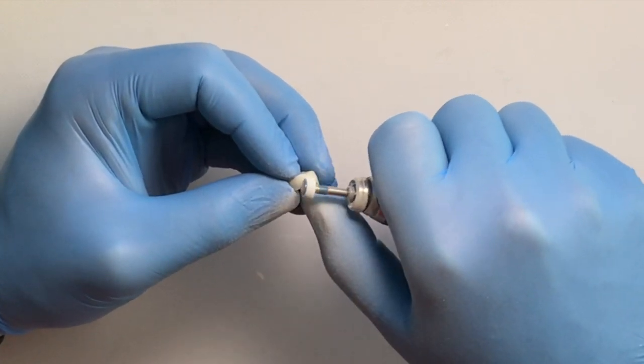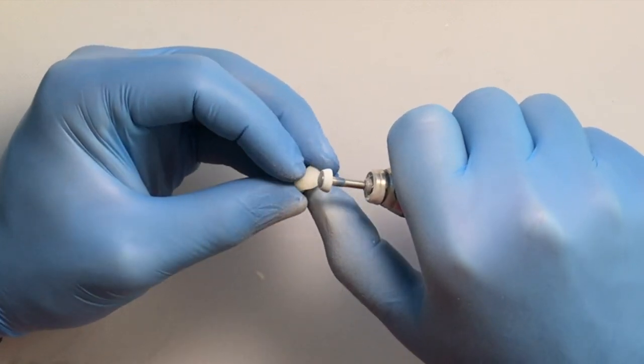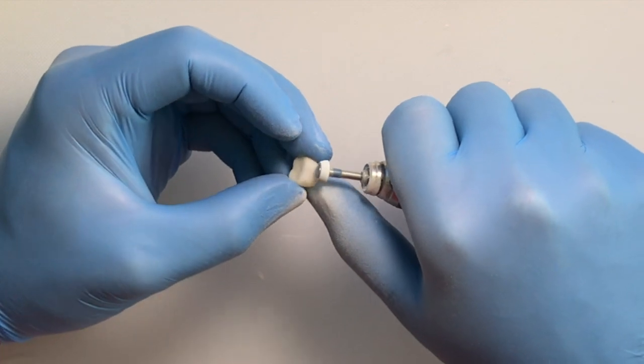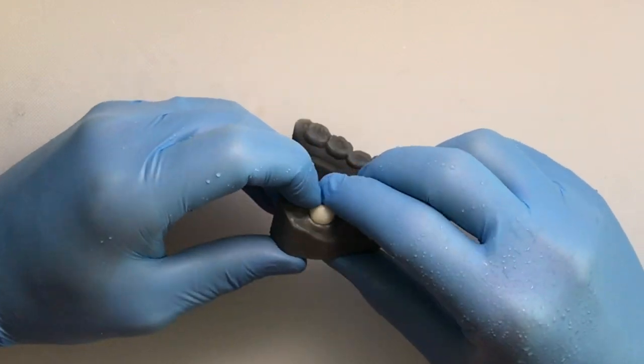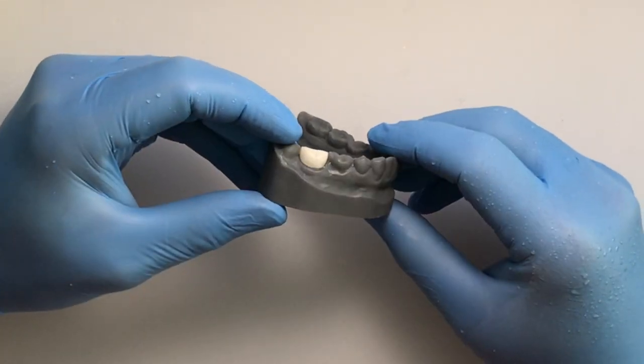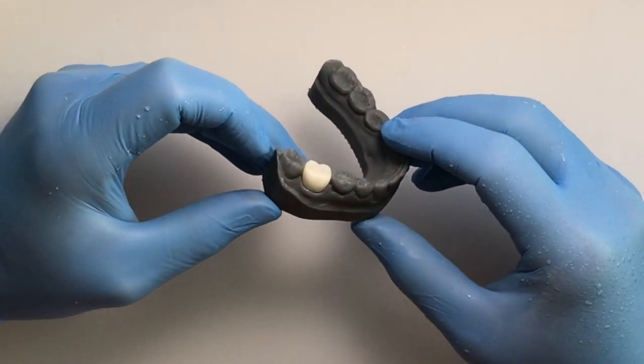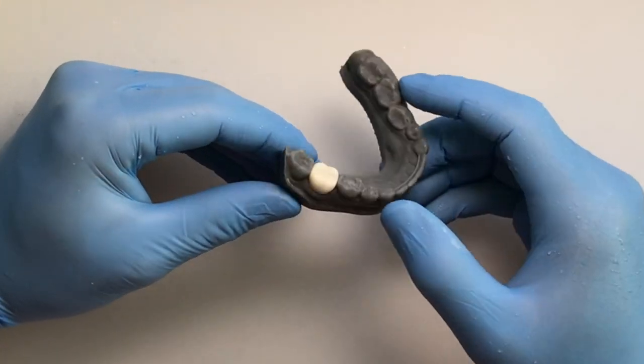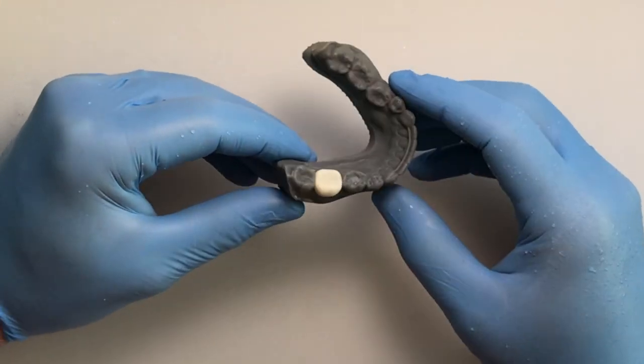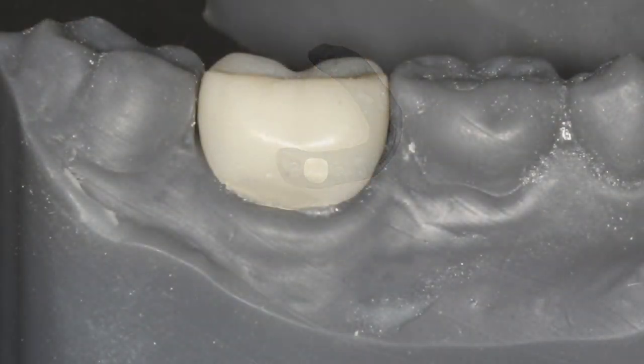Once we get this all completed, we then usually polish it with a rag wheel and pumice and water. Once it's completed, try it on the model or the tooth and make sure that the margins are sealed. As you can see, this makes a beautiful, nice shine and polished provisional. It fits well and adapts well to the model.